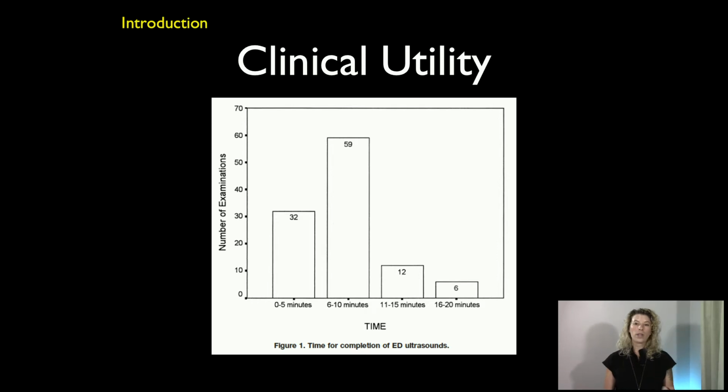So essentially what this graph shows is that the majority of biliary ultrasounds that we do at the bedside occur in 10 minutes or less. So that's like nothing in the world of emergency medicine, right? Like we take sips of water that take longer than 10 minutes. So it's a great fast way to diagnose, and it definitely is something that you should practice because the more you practice, the less time it takes.